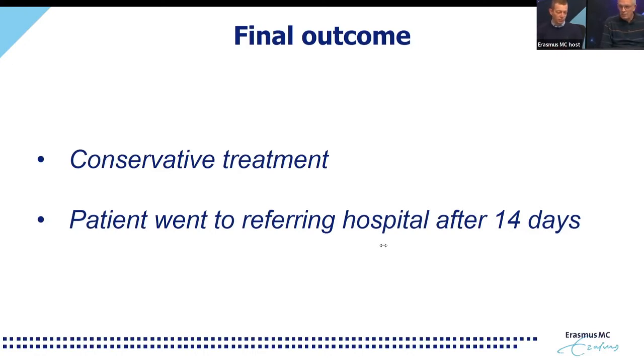In case of hematomas, you could, of course, attempt to dislodge the blood from the subintimal space by using cutting balloons, which means that you also damage the endothelium and might increase the vulnerability of the patient to additional thrombus and thereby acute occlusions.